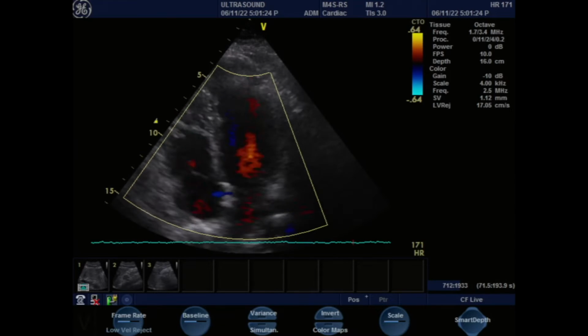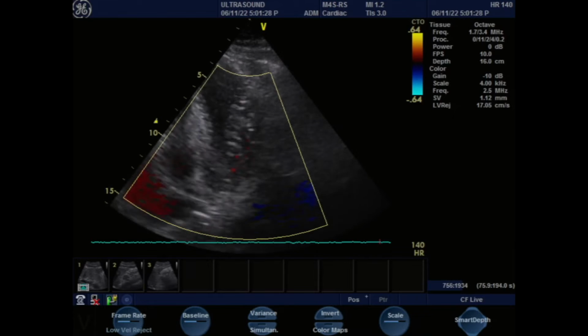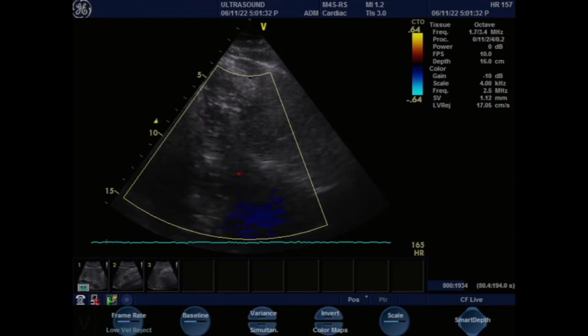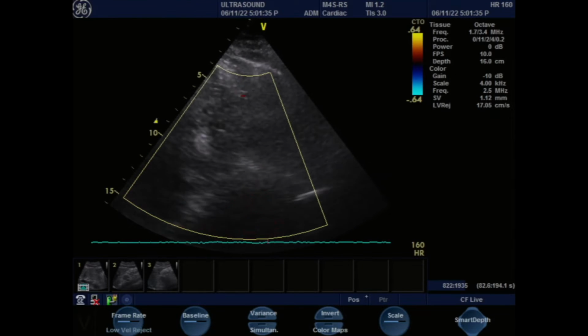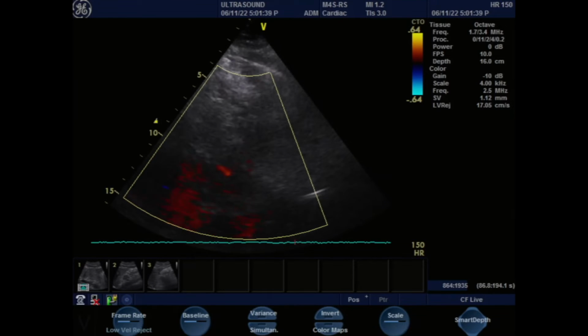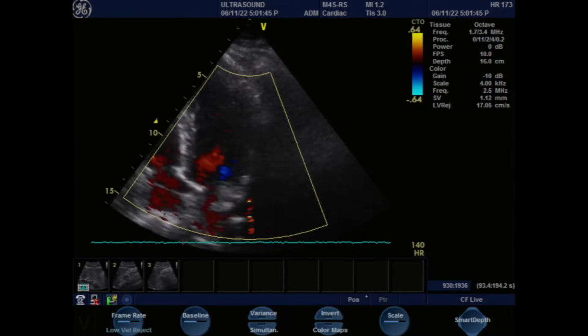Now, if we had valve problems, we would see this, because this is, again, an open valve, so blood is flowing very linearly and just goes down, and there's a single net vector of blood going down, and a vector of blood leaving the heart. Now, if he has mitral stenosis, you would see all kinds of colors over here. You'll see yellow, blue, green, everything, because blood is just trying to go this way, that way, trying to get into the heart.